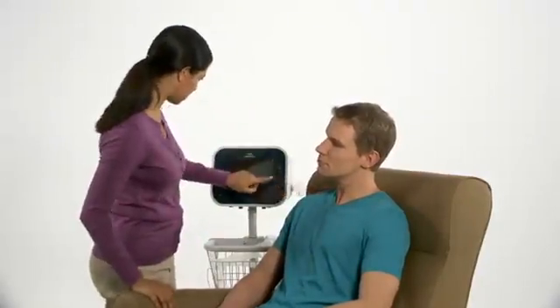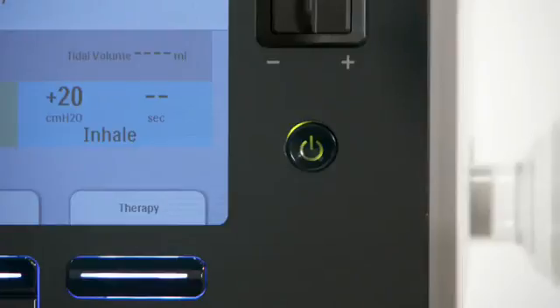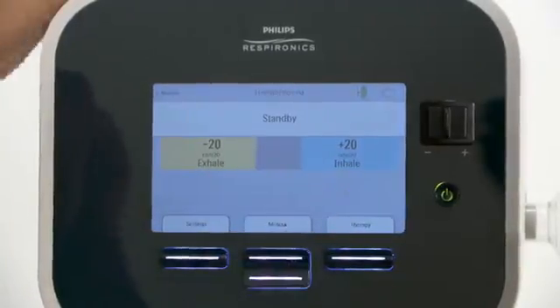Press the round Start/Stop button on the front of the CoughAssist T70 to enter standby. If the device is running on AC power, the button will illuminate. Check the treatment settings to make sure they match the doctor's prescription.